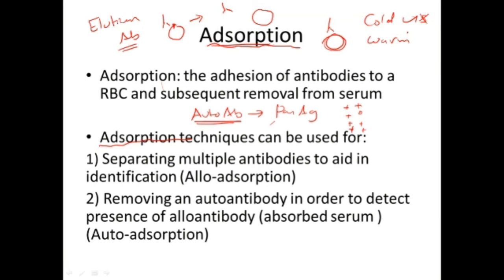طيب ذا سكرين والباك إن شاء الله soon. Okay, so we can use it to separate multiple antibodies. So بعض الانتيبوديز بنقدر حتى لو كانت اللو انتيبودي بنقدر نتخلص منها عن طريق تكنيك، نتخلص منها وبعدين نختبرها، مو نتخلص منها نرميها زبالة، لا نتخلص منها وبعدين نرجع نختبرها عن طريق الادسوربشن تكنيك.